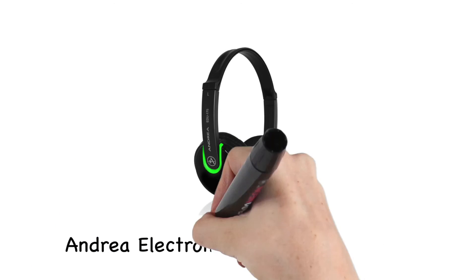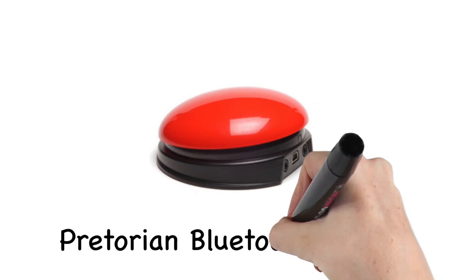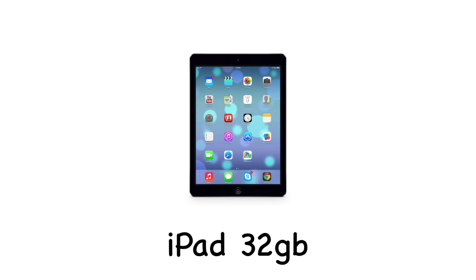There will be a pair of headsets by Andrea Electronics. There is also a switch inside the toolkit called the iSwitch Bluetooth by Praetorian. This could assist an individual with limited movement to access the computer.